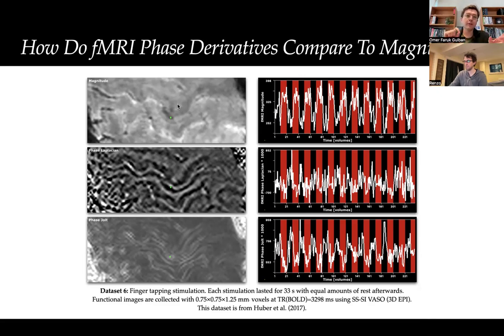But we discussed this a month ago with Ravi, and he was saying that at the end of the day, when you pre-process the MRI data, with motion correction, resampling, and so forth, you induce spatial smoothing anyway. So I think if you keep your kernel to the minimum when you compute the spatial derivatives, this is not the biggest concern. But indeed, it's a true statement that when you compute spatial derivatives, you are integrating more information from neighboring voxels.